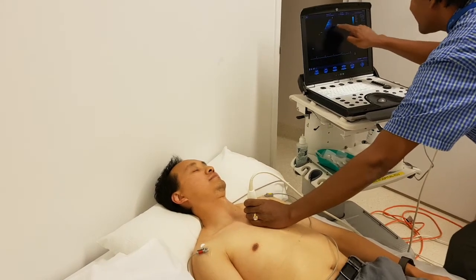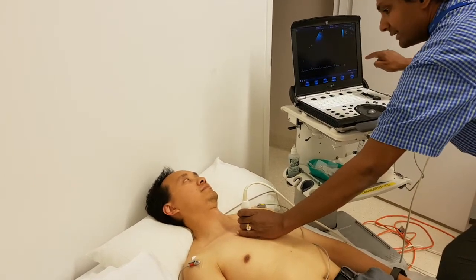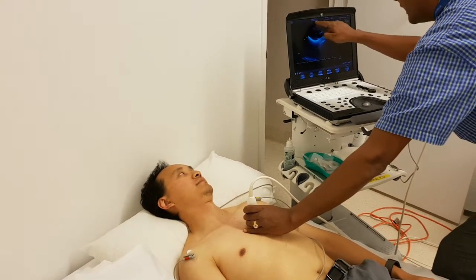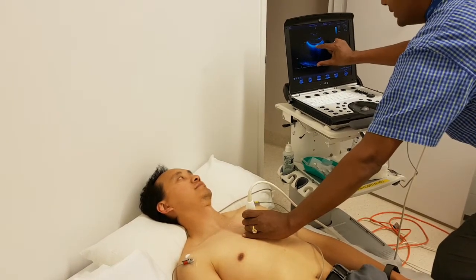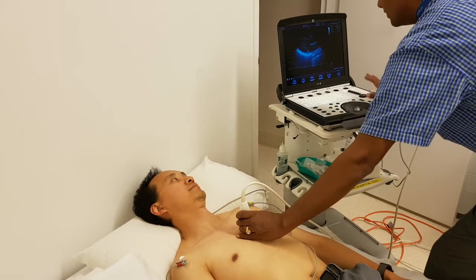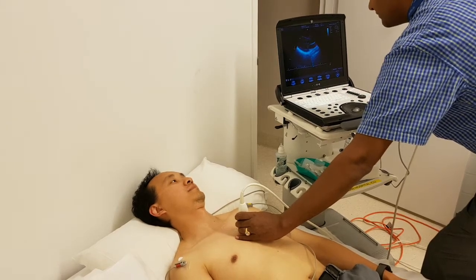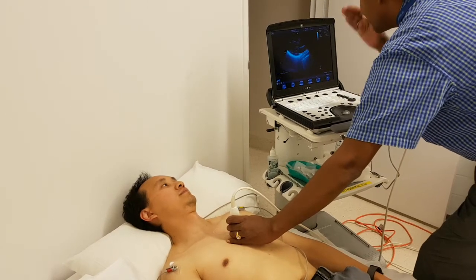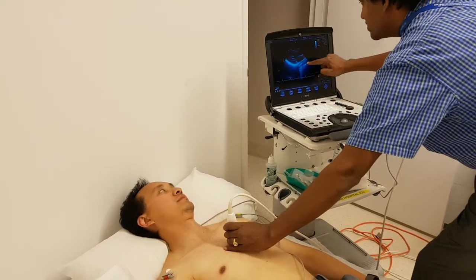As I come down, the first thing I see is a beautiful lung and the pleura. Continuing down, I begin to get an image of the heart, but the bottom 10 to 12 cm is unnecessary depth. So optimize the depth — for the first screening image, have a depth about 5 to 10 cm deep to the structure of interest. I store this, but from the next image onwards, focus on the structure of interest: have the depth just deep to the pericardium.